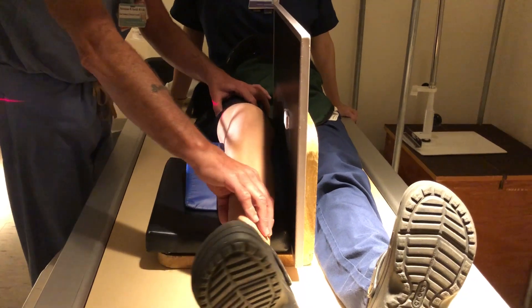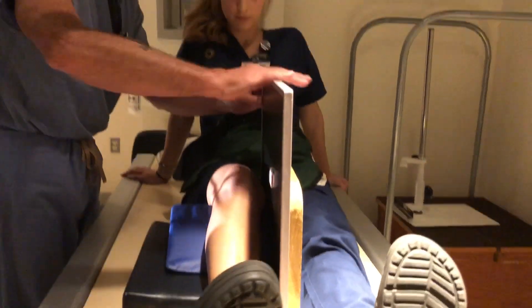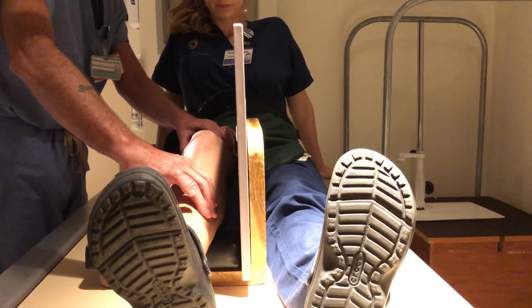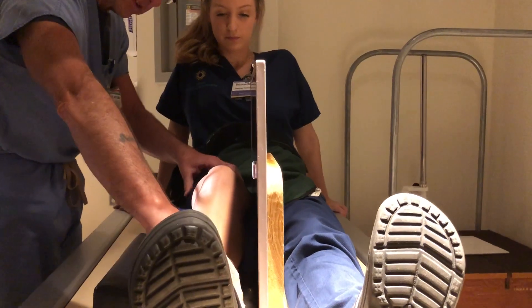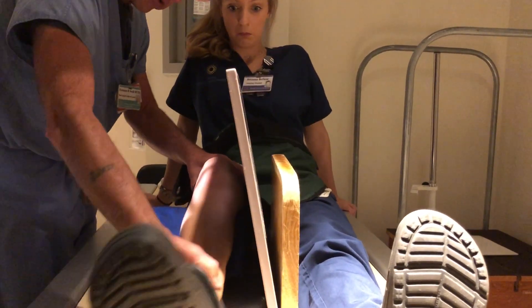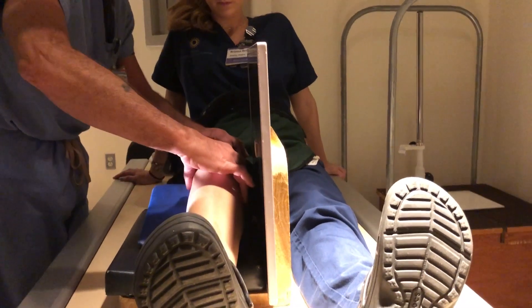Be careful of the leg being rotated this way or rotated too much medial. Also, you have to be careful of the film — it has to be nice and straight. You can't have the IR crooked at all, or you can't have the leg out this way or in this way at all. Everything has to be perfectly straight for this view to come out right.